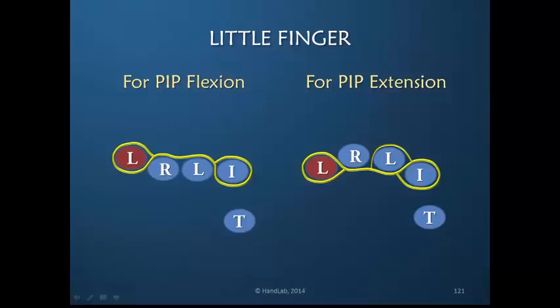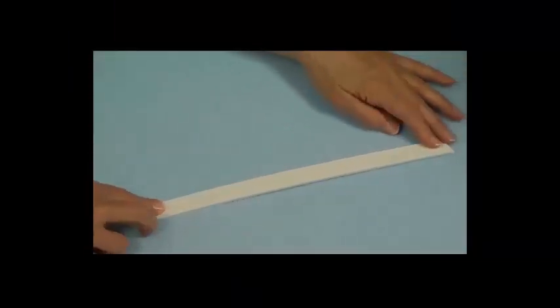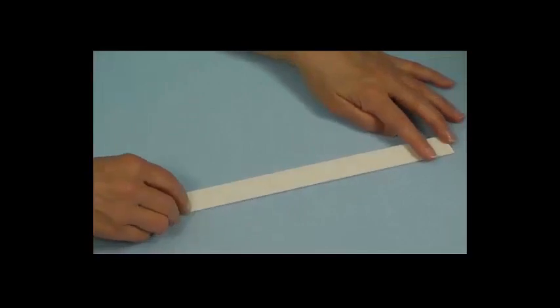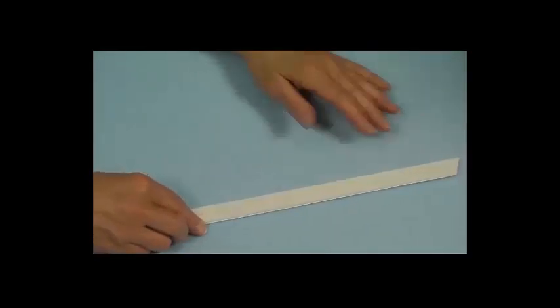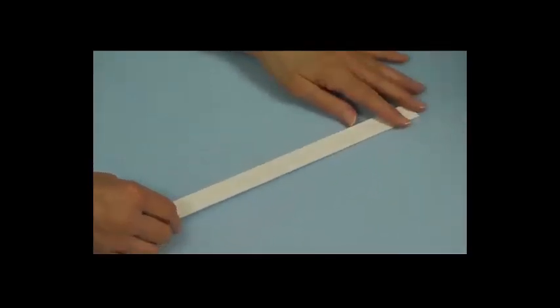Let's take a look at actually constructing a few of these active redirection orthoses to apply what we've learned to a clinical scenario. Today we have a model who does not have stiff PIP joints, but you'll be able to appreciate how we change the direction of motion. I have cut a piece of thermoplastic material approximately three-quarters of an inch wide, or two centimeters, to use to make this orthosis. In your clinic, as a time-saving approach, you could have these pre-cut and ready to go.